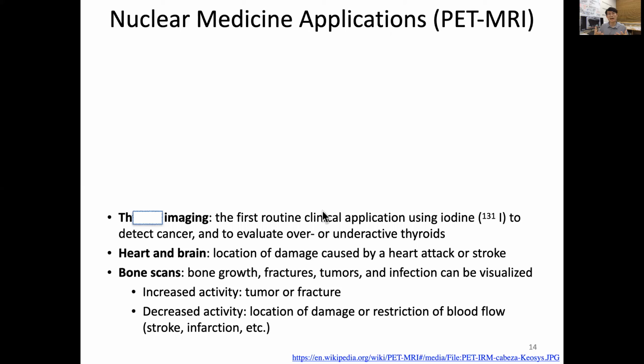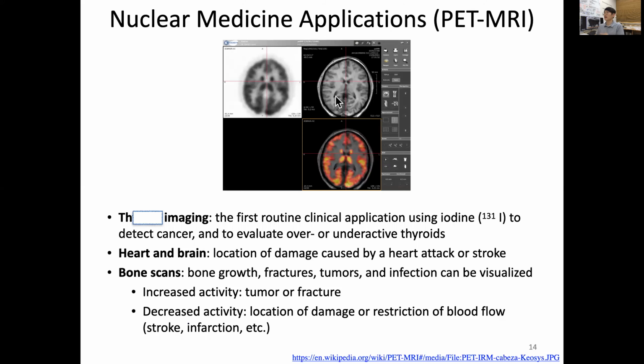The problem of PET is that it has extremely high sensitivity and specificity, while it provides a little poorer anatomical structure. So that's why PET can be combined with another more structural image such as CT or MR, and that gives us a better view of what's going on in the body. So here I put some examples of MRI and PET imaging. We can combine them together so that, overlaying under the structural anatomy, we can overlay the metabolic activity.